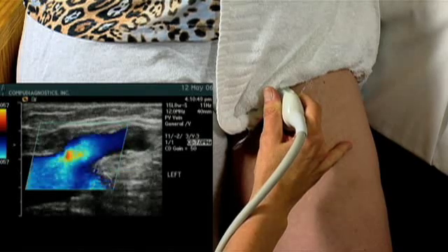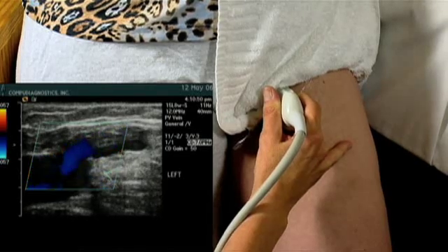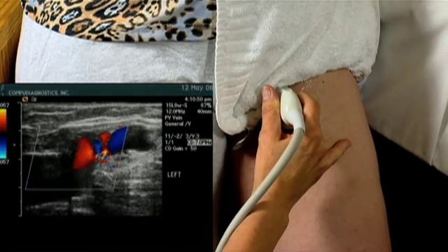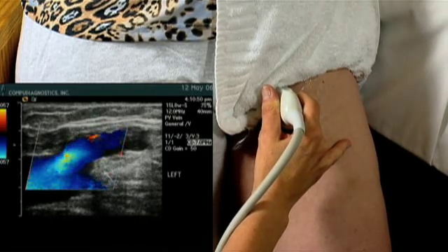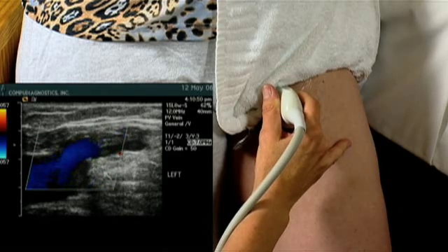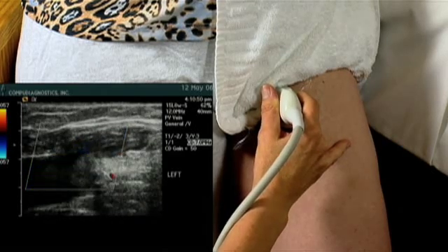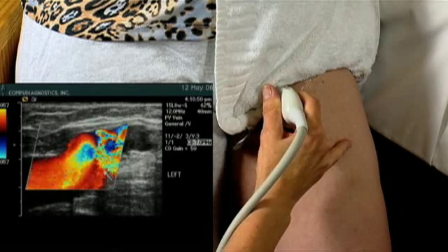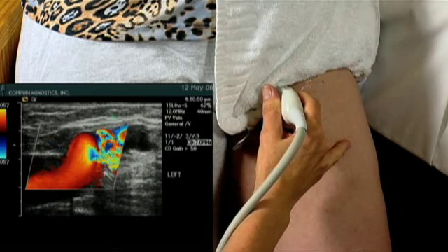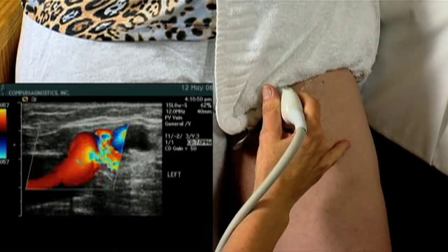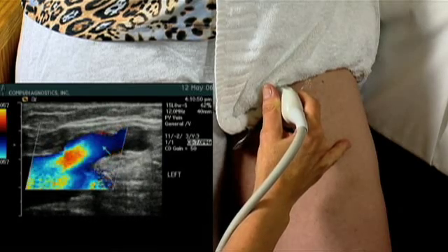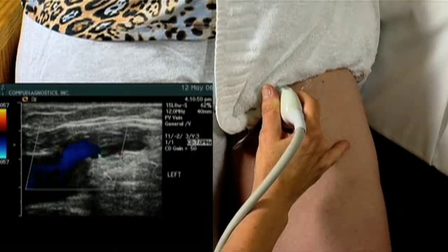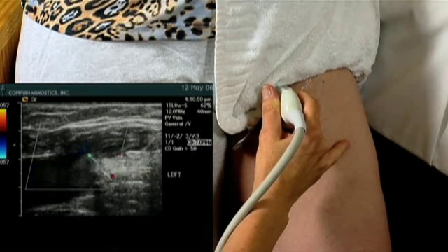We have the patient perform a Valsalva and release. We'll put this in CINI so we can demonstrate that in a slower format — with deep breath in, bear down — and retrograde flow from an incompetent terminal valve.